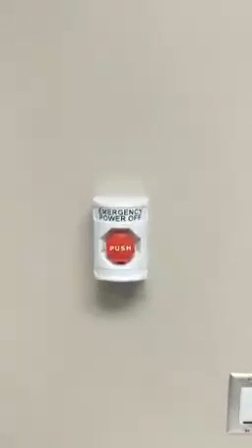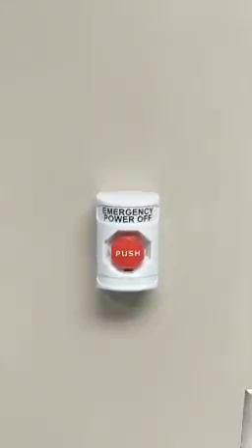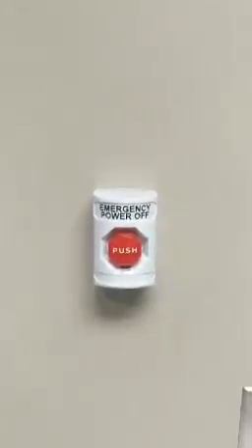The other button, located on the north wall next to the fire extinguisher, is the emergency power off button. This will kill electricity to the MRI scanner. This will be used in the events of a fire or a flood. It does not quench the magnet.